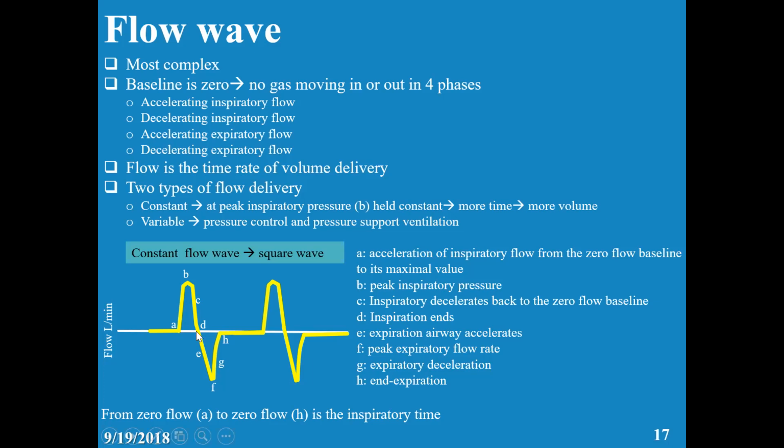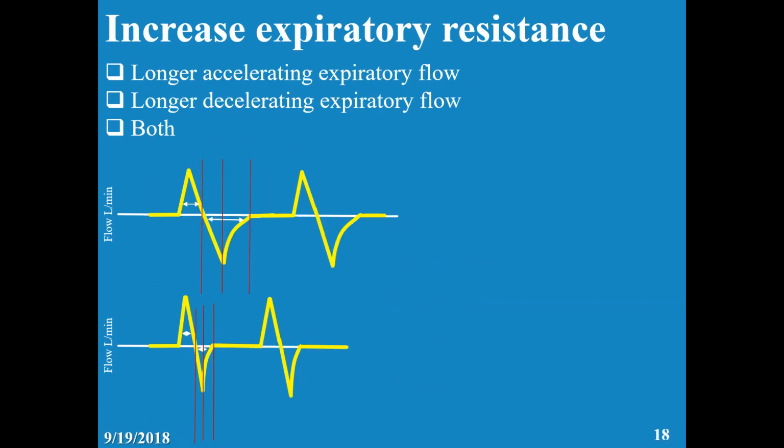And that's not good because the baby is breathing in and then right away out. There is no pause, there is no wait. So this is not good. Here is not good, but here is good. Here is good. Here is not good. There is no pause here. There is something wrong here.